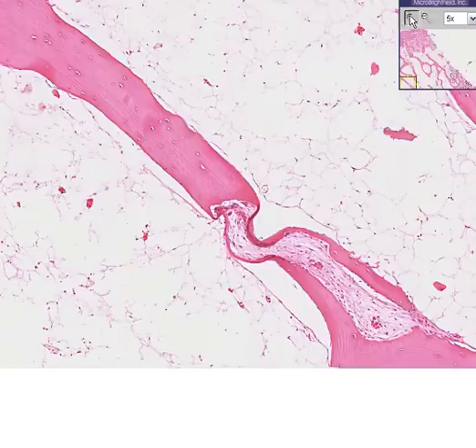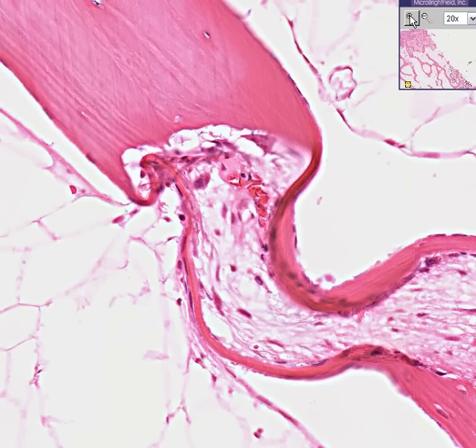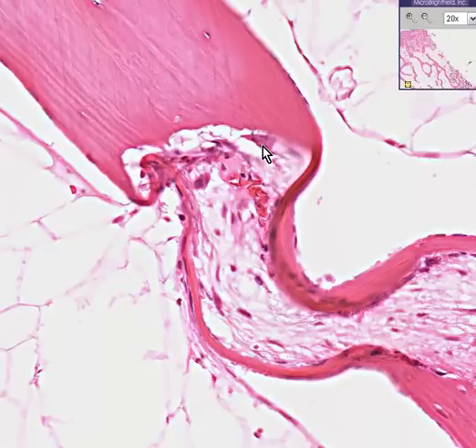Please note that in this bone we have a couple of osteoclasts chewing up the bone which are nothing more than multinucleated giant cells and transferring calcium from the hydroxyapatite into the bloodstream.